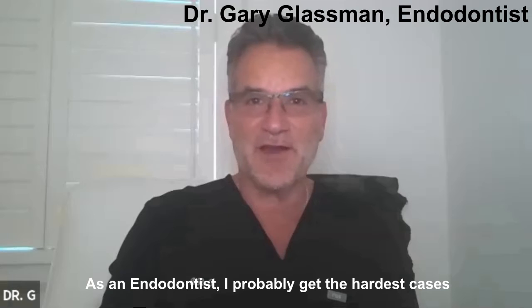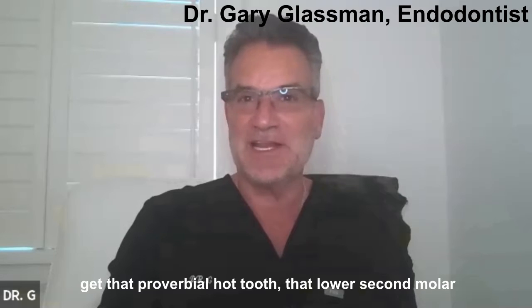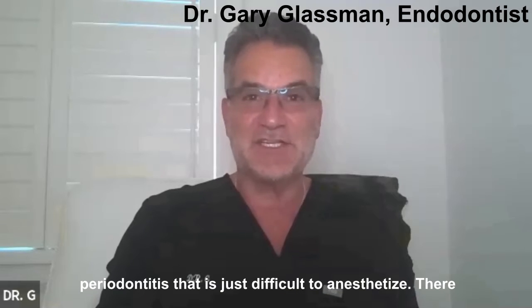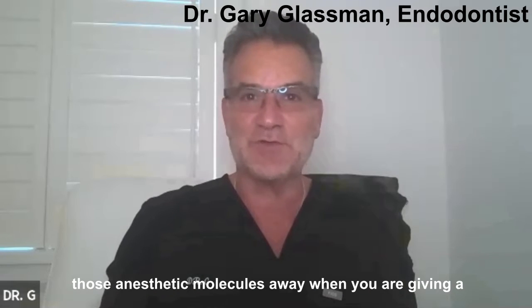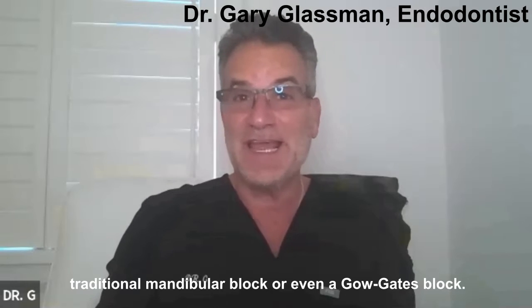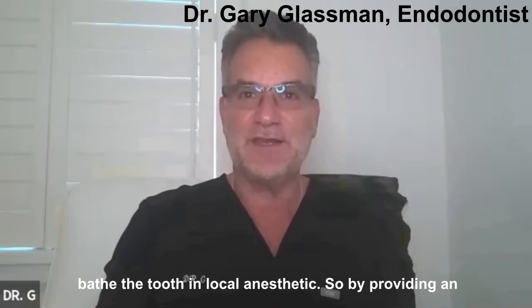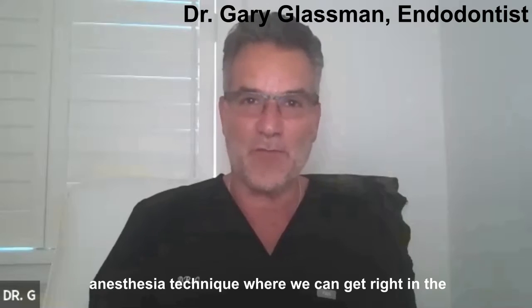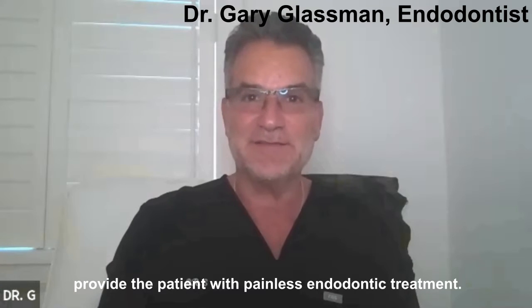As an endodontist, I probably get the hardest cases possible from my referring dentists. A lot of times I'll get that proverbial hot tooth, that lower second molar that has irreversible pulpitis with or without apical periodontitis, that's just difficult to anesthetize because there's so much inflammation around it that it pushes those anesthetic molecules away when you're giving a traditional mandibular block or even a Gow-Gates block. So we have to get right into the cancellous bone and bathe the tooth in local anesthetic. By providing an intraosseous, or more aptly named osteocentral anesthesia technique, where we can get right into the cancellous bone near the apex, we're able to provide the patient with painless endodontic treatment.